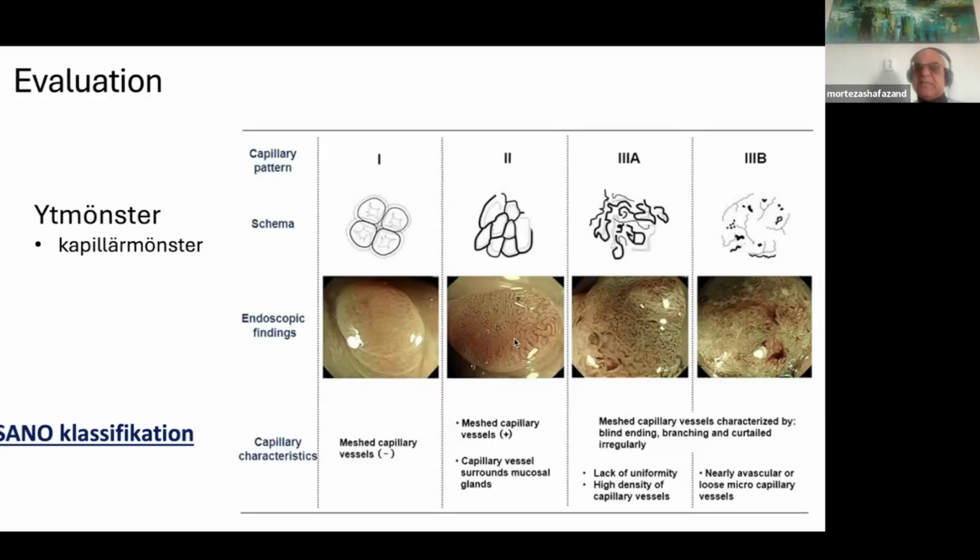This is a very, very important point that you touched on: look at the whole lesion, then break it down piece by piece, millimeter by millimeter, and make your decision. Very good. Yeah, I fully agree with you.